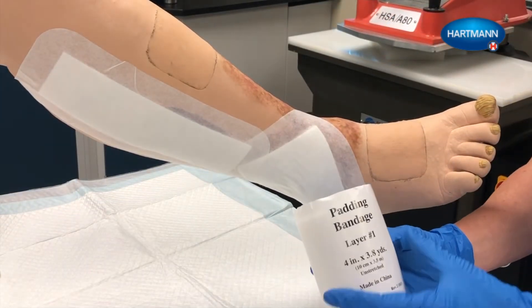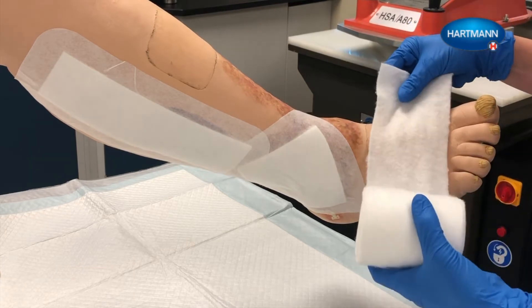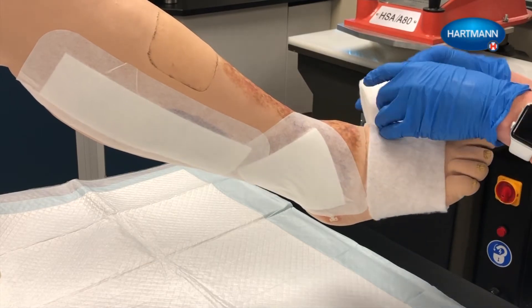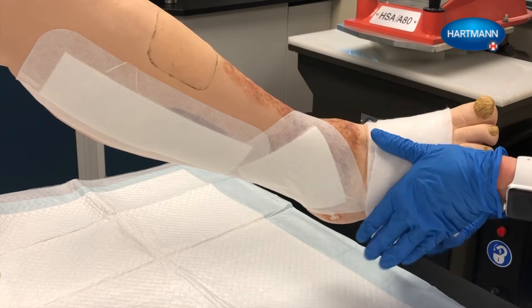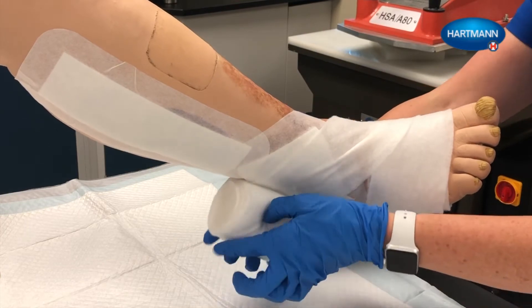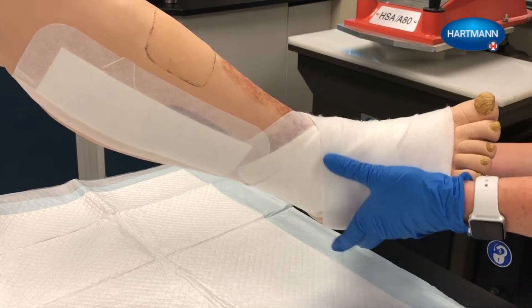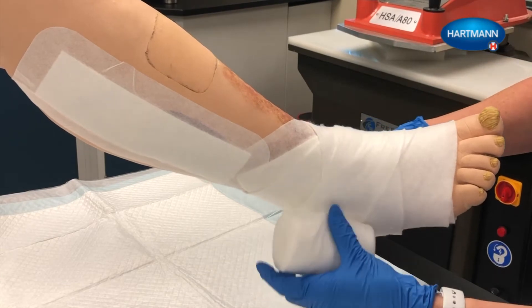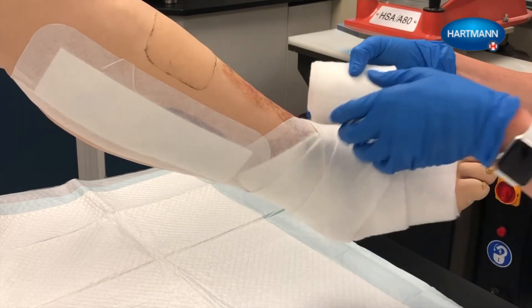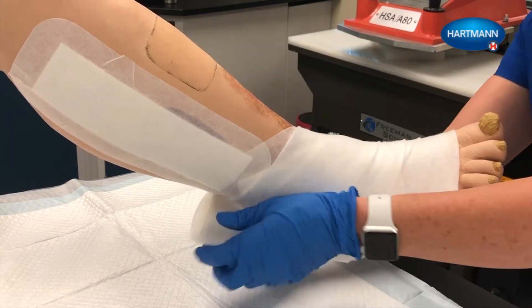Layer 1 is the padding bandage. Wrap the padding absorption layer with the fluffy cotton side against the skin. Start applying the bandage proximal to the base of the toes. After 2 turns for fixation, wrap the bandage across the back of the foot and then enclose the heel. Stretch this layer around bony prominences such as the heel to increase conformability. Using a spiral technique with 50% overlap, continue to wrap the leg to just below the knee. Smooth the bandage after each turn.